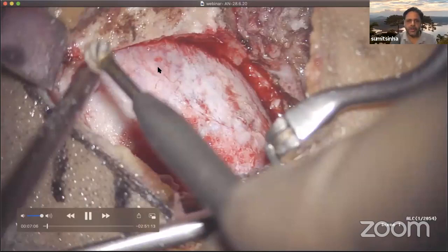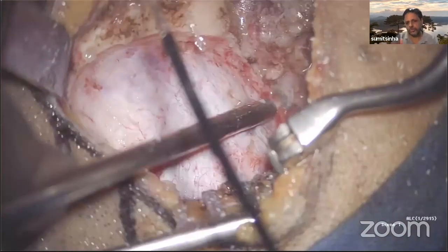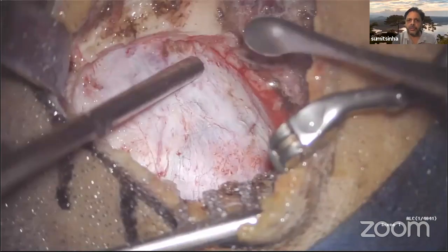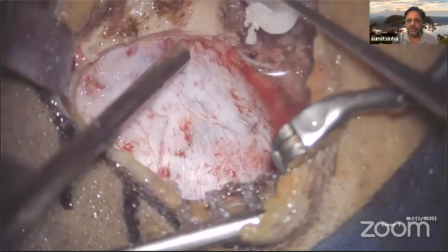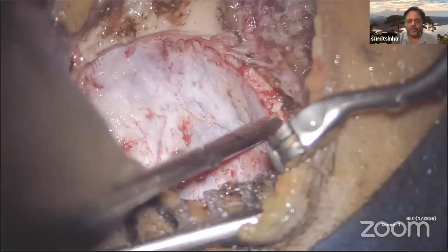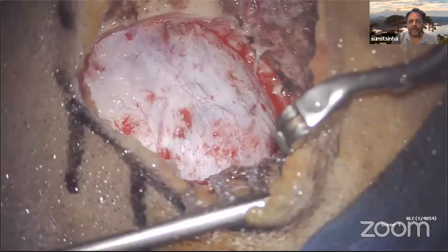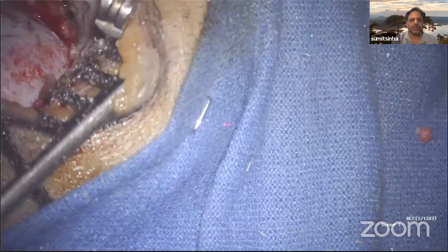So this is ready now. The bone work is complete, and you can see there is no utility in giving a long incision and going all the way down the neck. You have the access, whatever you want to do, with this 4 centimeter long skin incision and 3 centimeter wide craniotomy. There is absolutely no reason for a long incision.